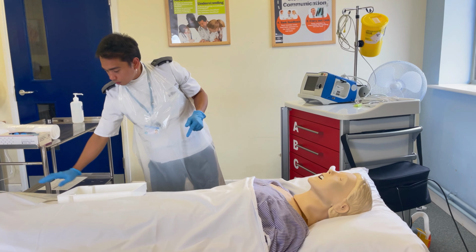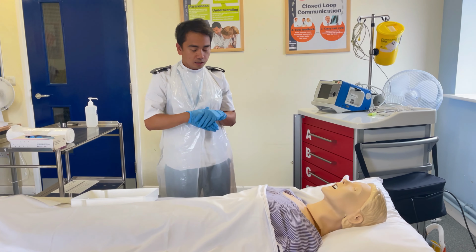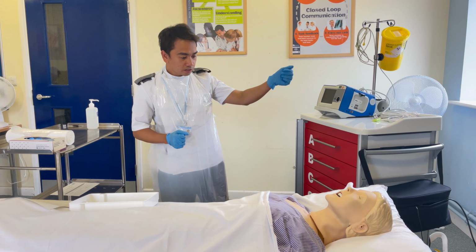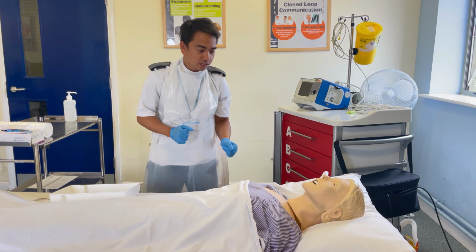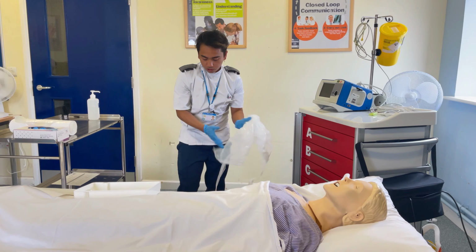If you have any questions, just let us know. We'll be leaving you the call bell. Just press the orange button if you need us, and me or my colleague will be there, okay? So I'll just remove this and dispose of it in the clinical waste bin.